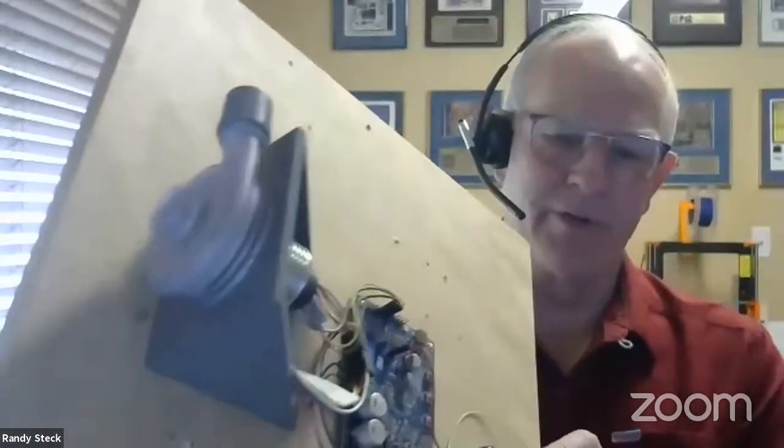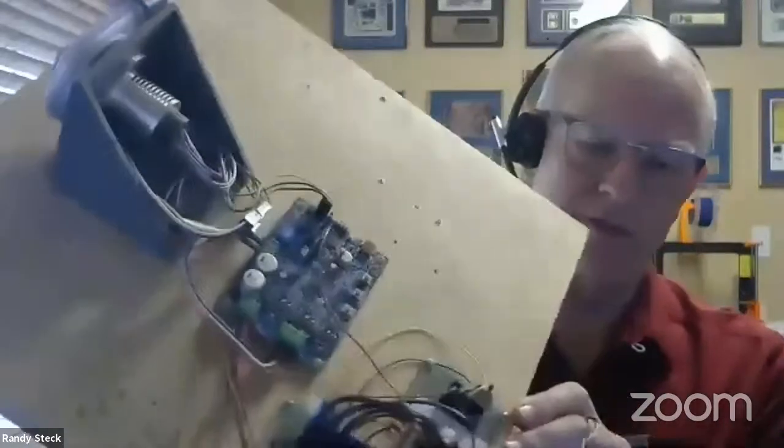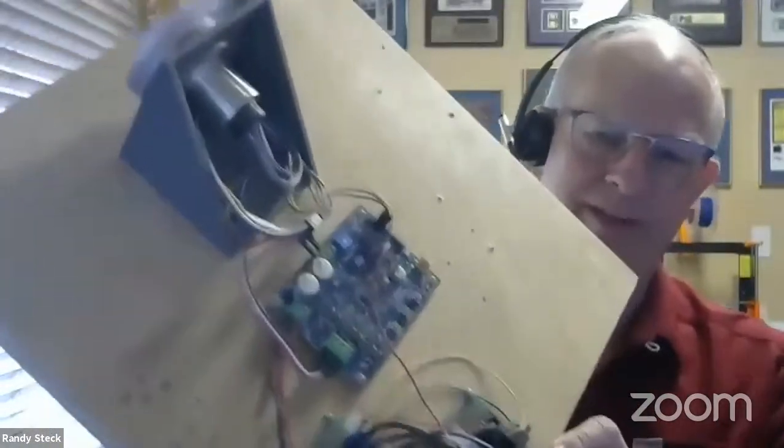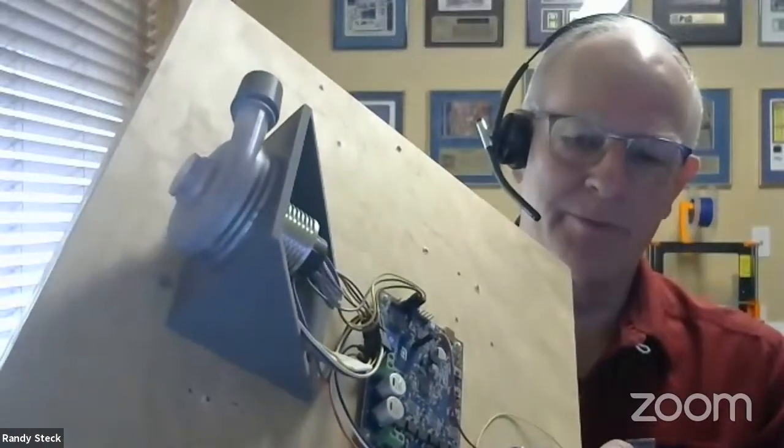Oh yeah, I think Randy has one blower actually showing in this camera. Maybe Randy speaks so you pop up for everyone. Yeah, this is the blower that he's talking about. It's much smaller than the AMBU bag. This is literally the breadboard that we were using to model this system on, and this is a blower replacement for the stepper.